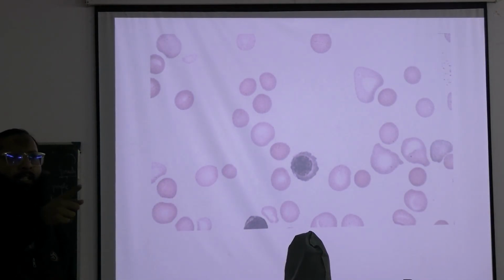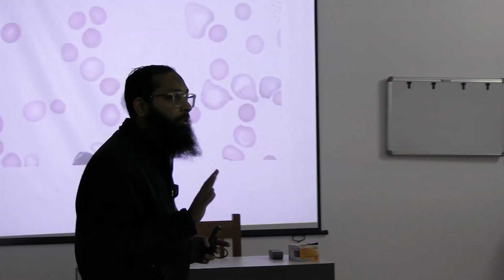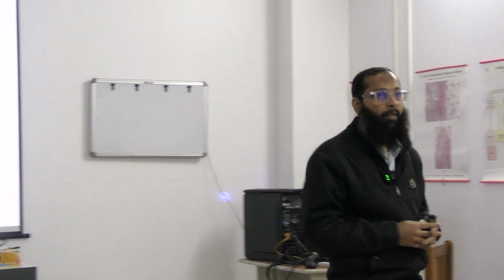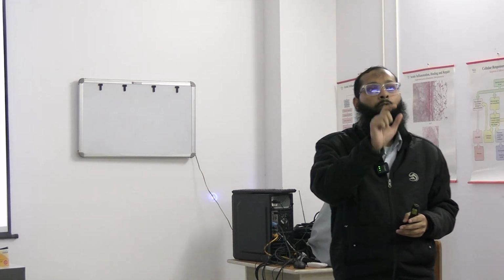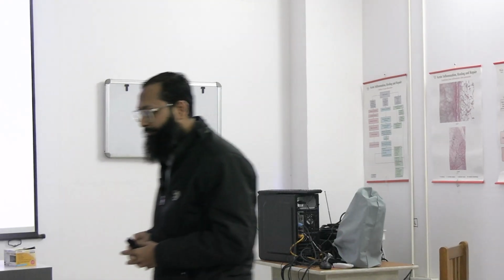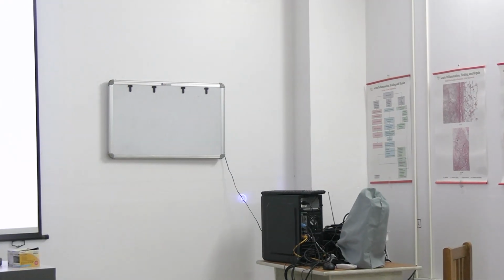Monocyte, you are describing? Eosinophil. No, not the size of an RBC. It is double the size of an RBC. Actual dimension 12 to 16 micron. Okay, now continue. Granules are present.